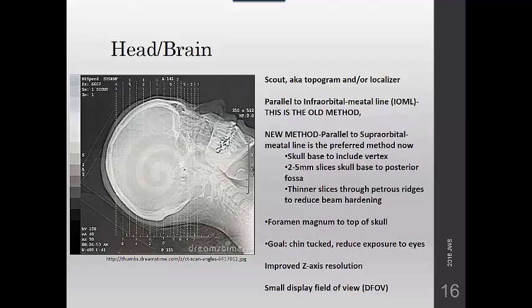acute stroke patients. With older generation single slice scanners, CT heads could take as long as 5 minutes to scan, but today the scan time is measured in seconds. So it is the most ordered scan because it's become a fast, effective means of ruling out life-threatening medical emergencies.